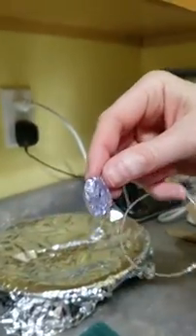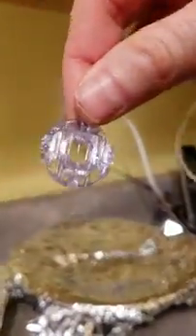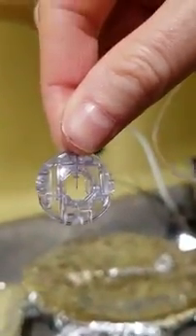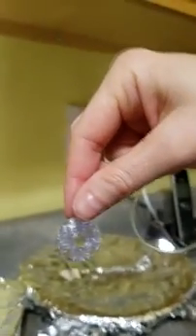I like to shut this thing. I guess it is shut. Okay, so I hit OK, and then it says press and hold the OK button while priming the tubing. So I'm going to do that, and I'm going to wait for some insulin to come out of there. And there it is. So hope you saw that.